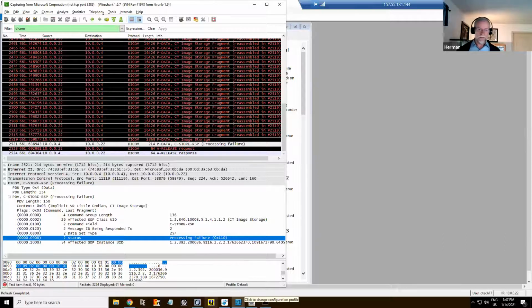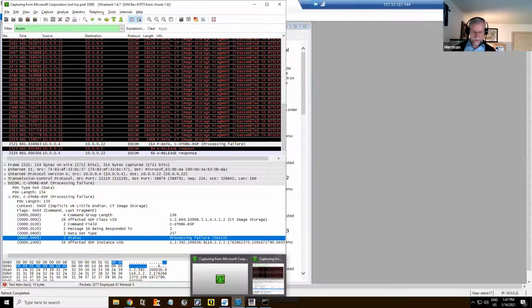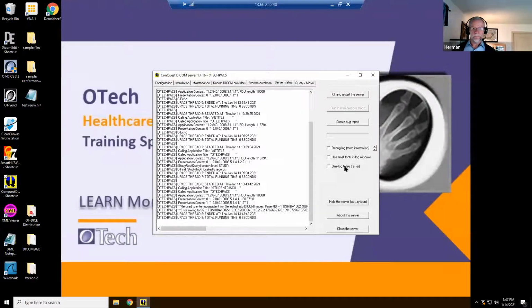Now I can go back to my PAC system and say, what did it complain about? Right? So let's go look at the PACs. What does it say here? It said refused to enter inconsistency series instance into the DICOM image patient ID, error saving to SQL. So the image that I was trying to send had an inconsistency. It was already in the database with different information. So it says processing error.